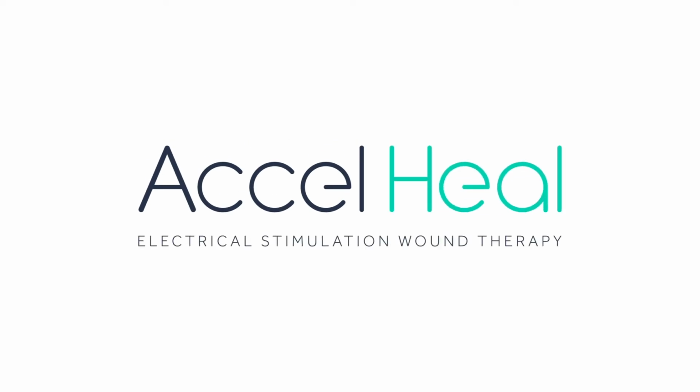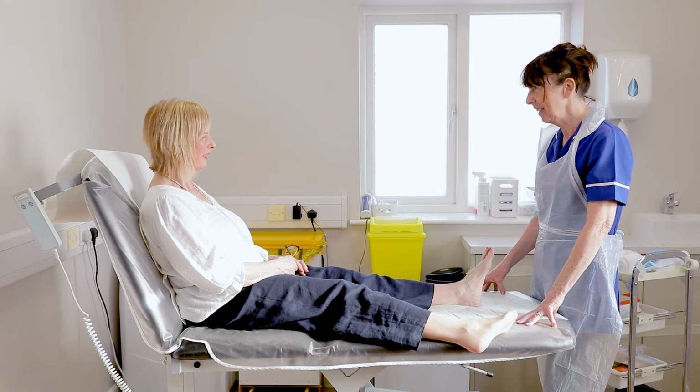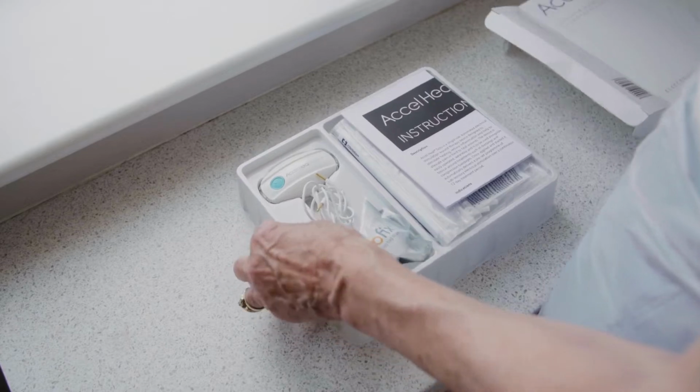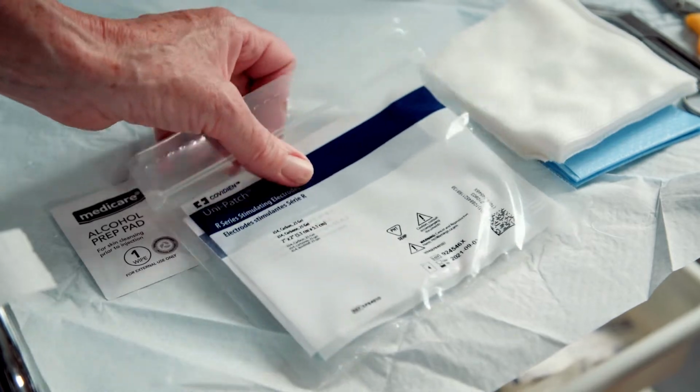This instructional film is intended to demonstrate the application of Accel-Heal Solo for a wound on the dorsum of the foot. Our process starts once the primary dressing has been applied to the wound. Make sure you have everything ready and close to hand to ensure an efficient dressing change for your patient.